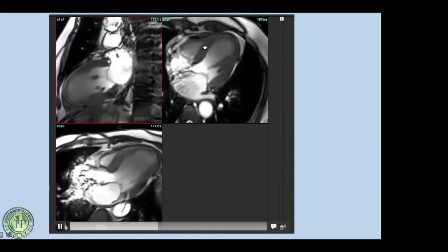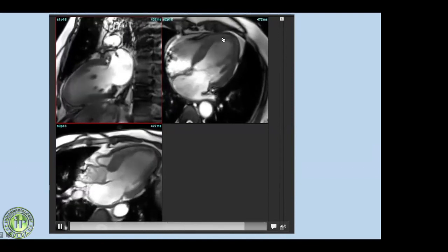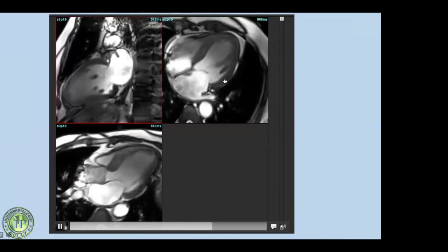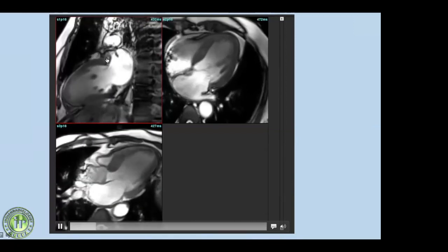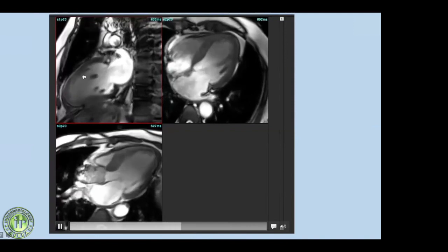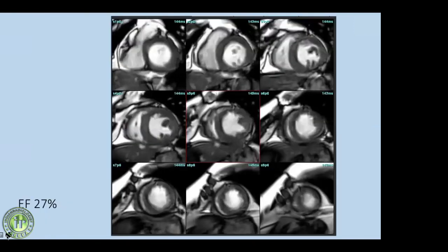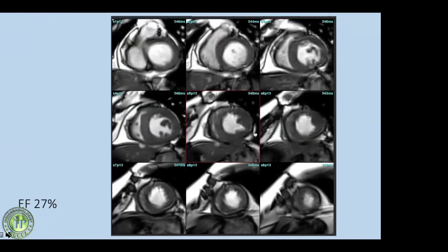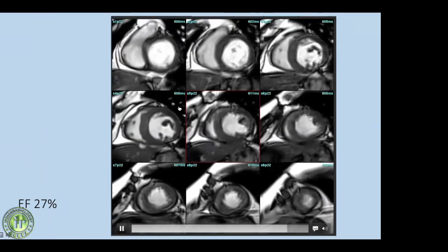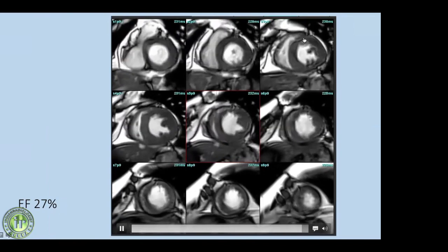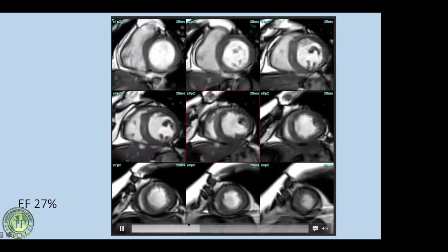As seen on 2D echocardiography, there is akinesia involving all apical segments and the interventricular septum; the lateral and inferior walls are moving well. The anterior wall and apical segments are akinetic on long-axis images. Short-axis cine stack images in this acute MI show no myocardial thinning — which is typical of chronic infarction — but there is definite akinesia of the anterior wall, interventricular septum, and all apical segments. Ejection fraction was significantly reduced at around 27 to 30 percent.